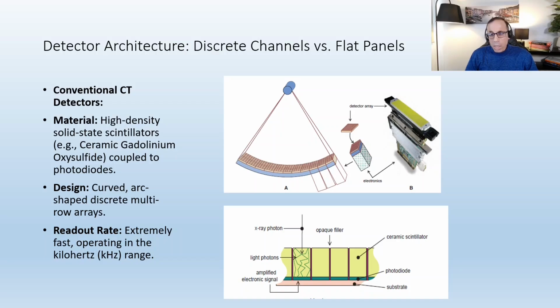When the light hits the photodiodes, its energy frees electrons inside the silicon. This movement of the electrons creates an electrical current which the computer reads to form the final image.